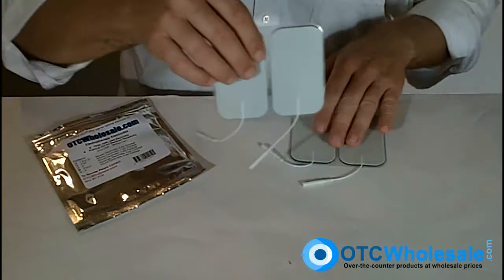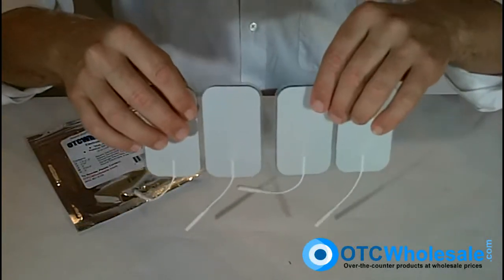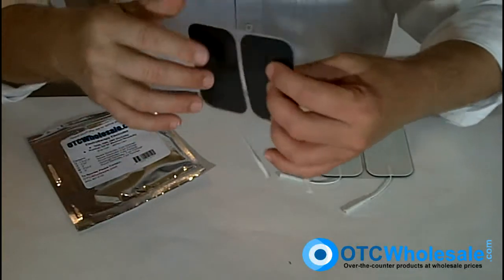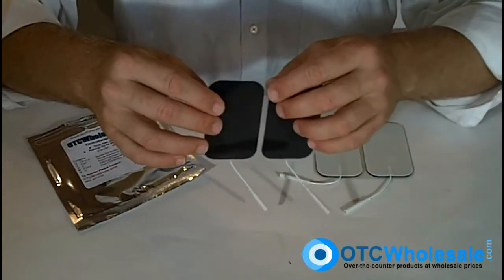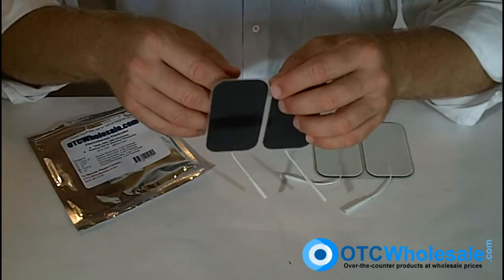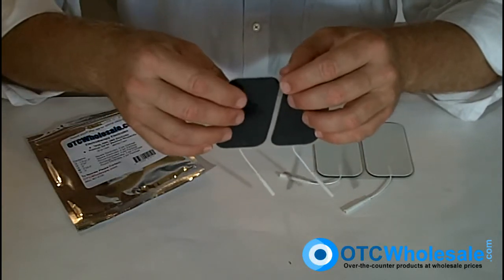The electrodes themselves look like this. They arrive on plastic cards, two electrodes per card. This is a great electrode for larger stimulation areas such as the thigh muscle or around a calf muscle.